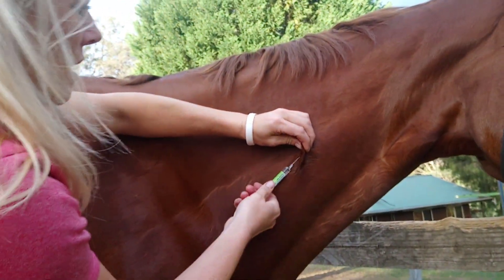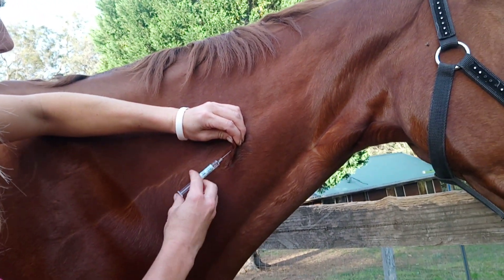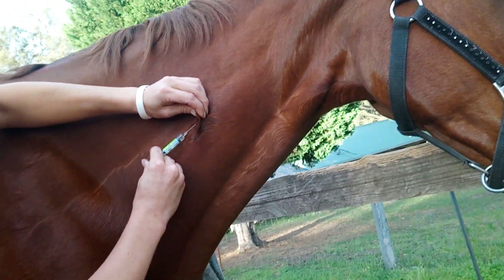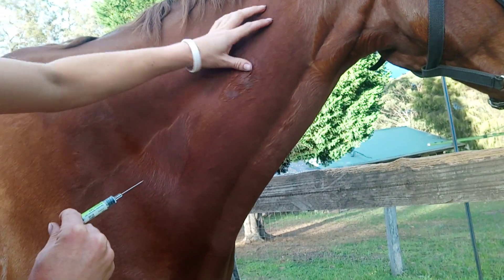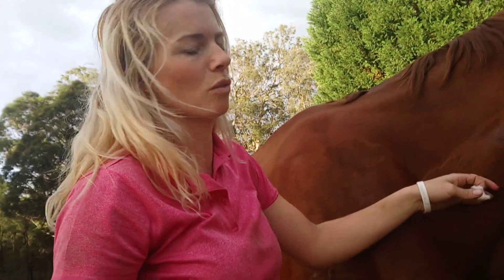We're going to draw back on it, make sure there's no blood. There's not. If there was blood in there, it would mean we'd hit a vein and we need to do it again. And we're just going to inject it right in there and then pull it out. And then we're just going to give the area a little rub — we'll use that swab again. Sometimes you don't need to rub them too much, so you don't want to mess with it.